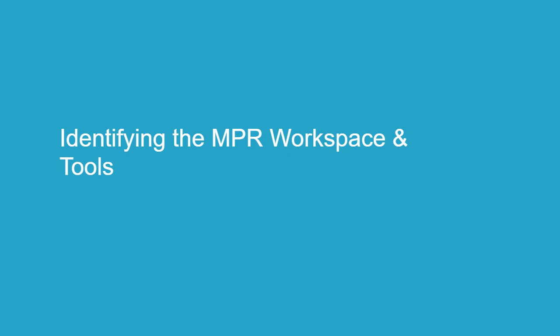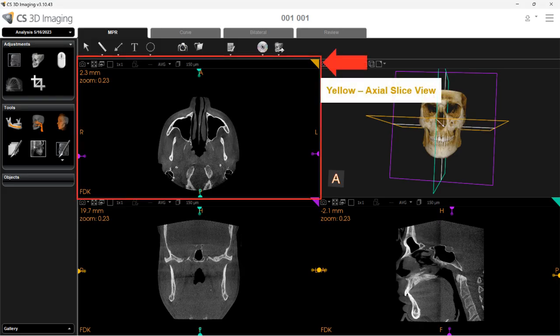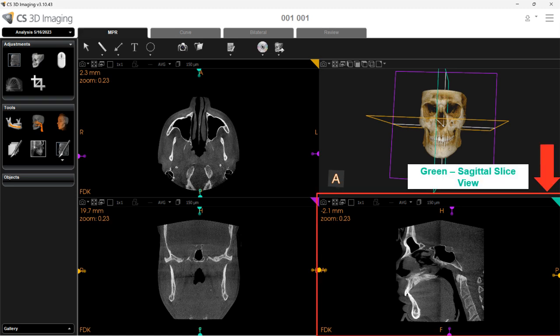Identifying the MPR workspace and tools. The MPR tab provides 2D MPR views and a rotatable 3D view. In the view screens, yellow represents the axial slice view, which displays horizontal slices allowing you to view them superior to inferior, or from top to bottom. Purple represents the coronal view, which displays vertical slices allowing you to view them anterior to posterior, or front to back. Green represents the sagittal slice view, which displays vertical slices from medial to lateral, or right to left.